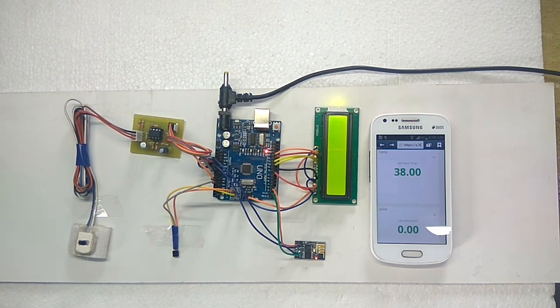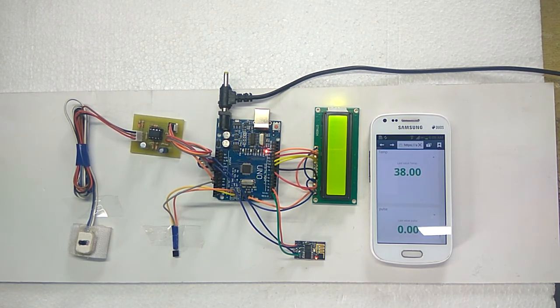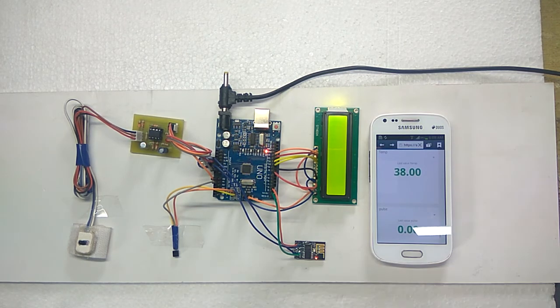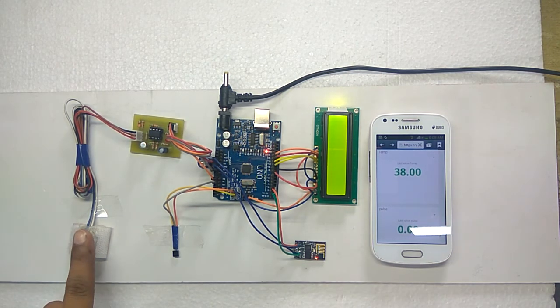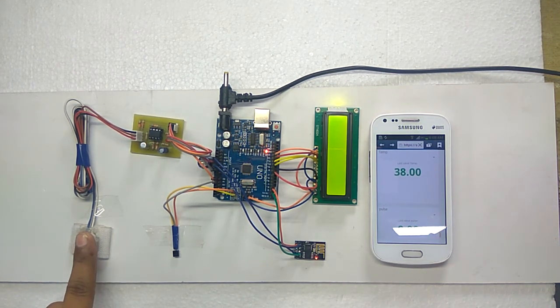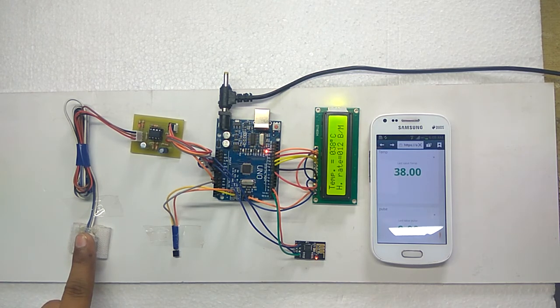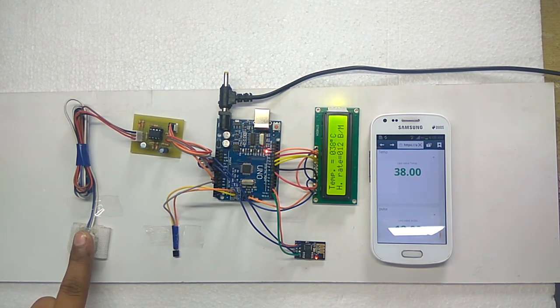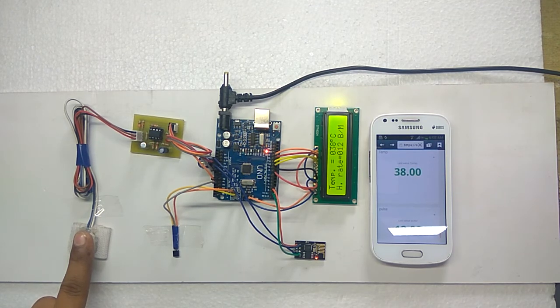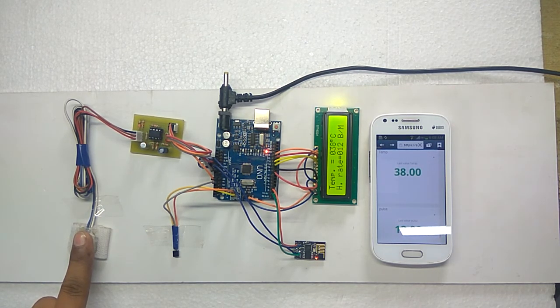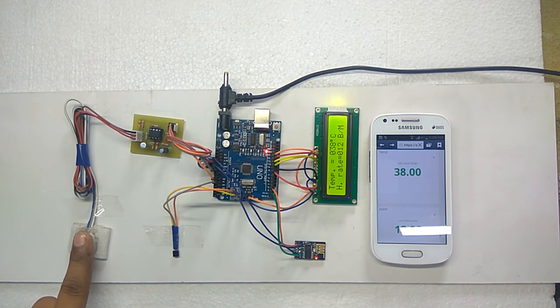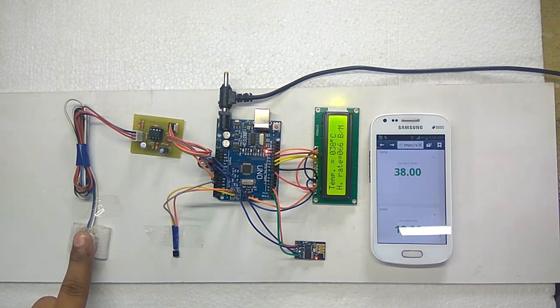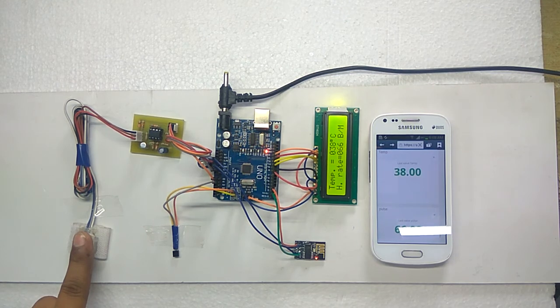Now we are keeping the fingertip on the heartbeat sensor. The blinking LED shows the heartbeat. The Arduino counts heartbeat for 15 seconds and calculates for 1 minute.